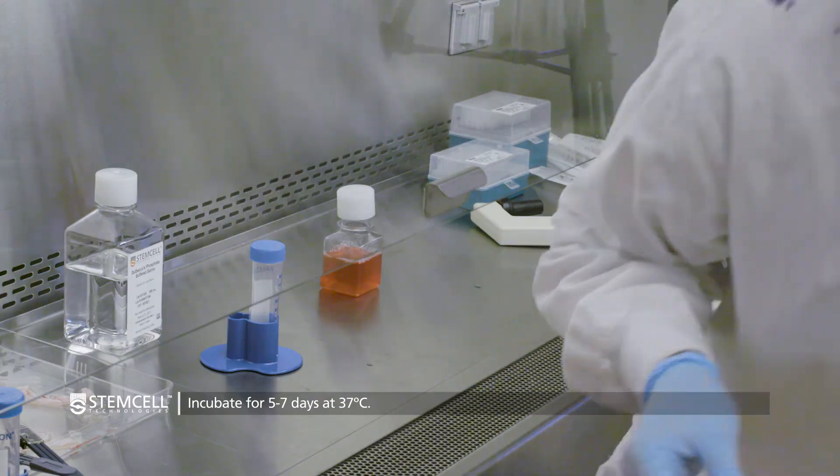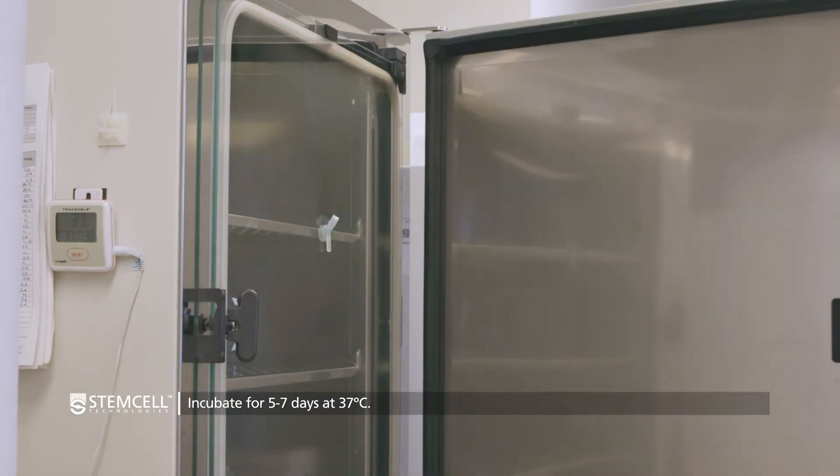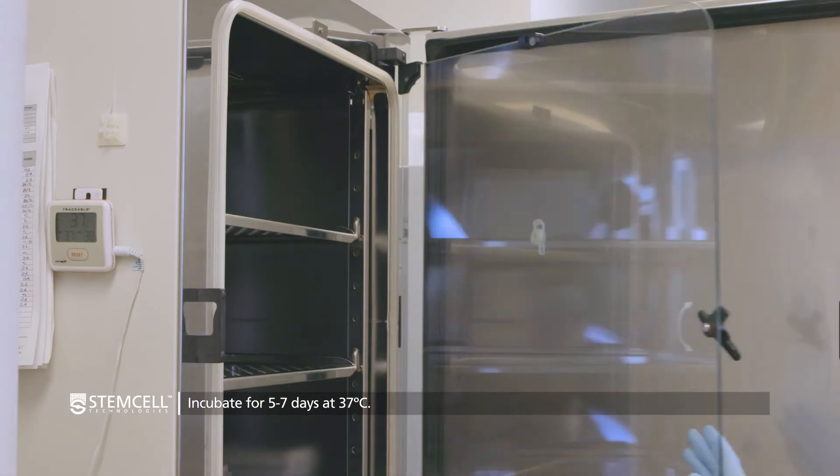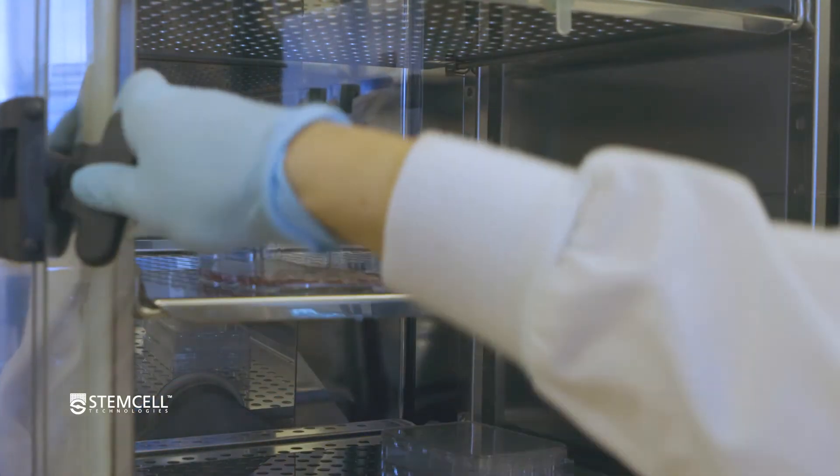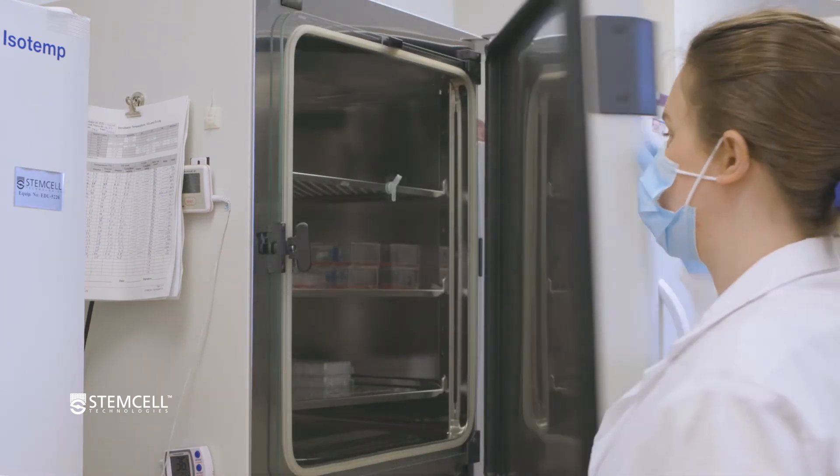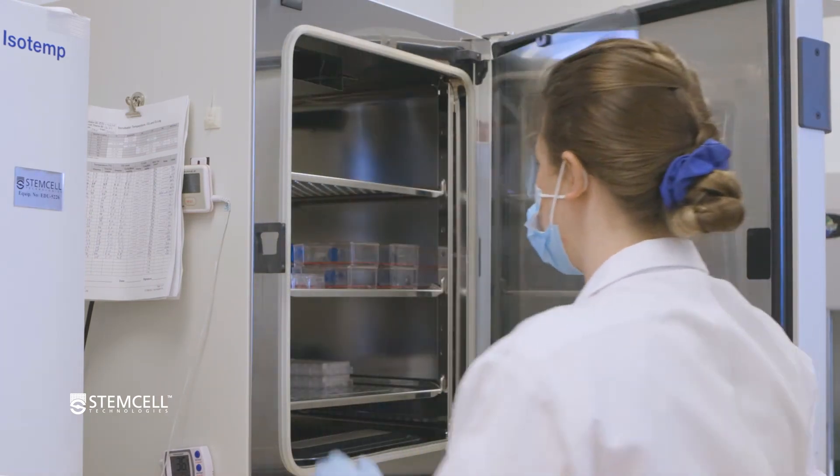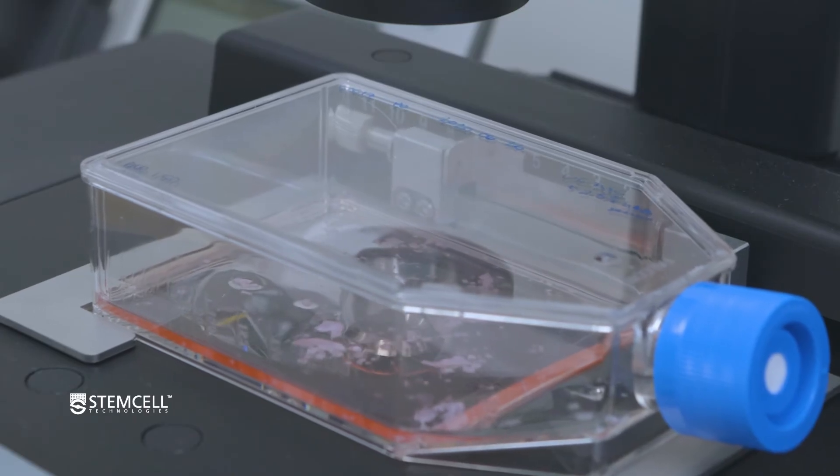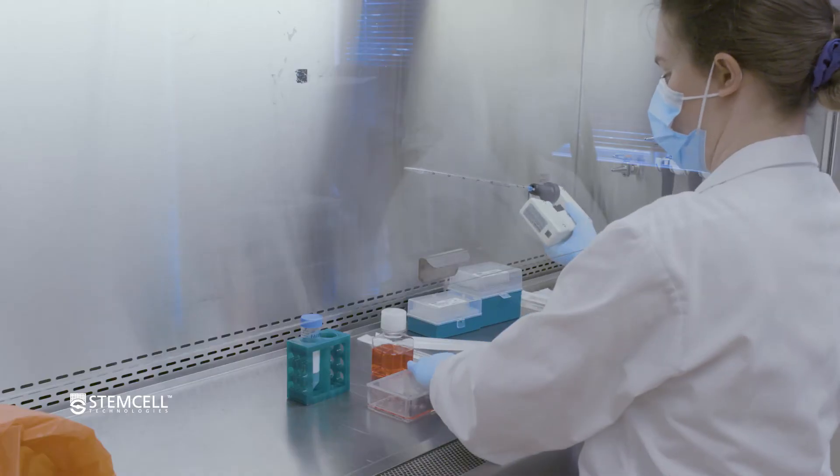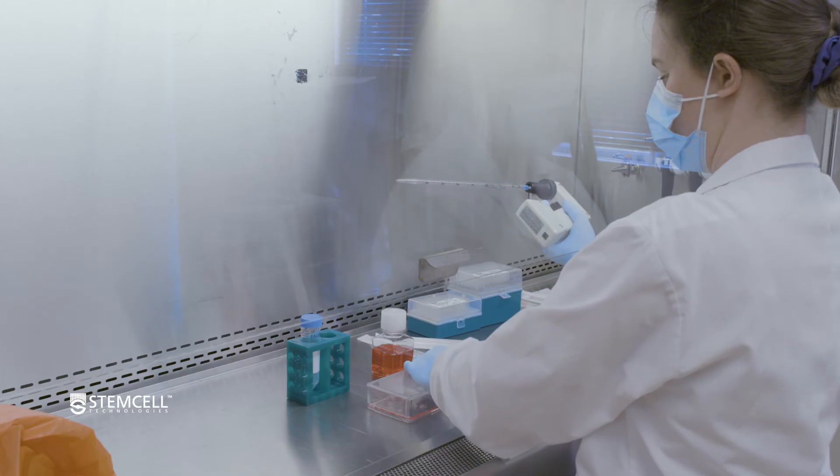Incubate the flask undisturbed for 5 to 7 days at 37 degrees Celsius. Do not allow the media to fully evaporate or turn yellow. After 5 to 7 days, most tissue pieces should have attached to the flask. At this time, perform a half-medium change with complete MesenCult ACF Plus umbilical cord medium.